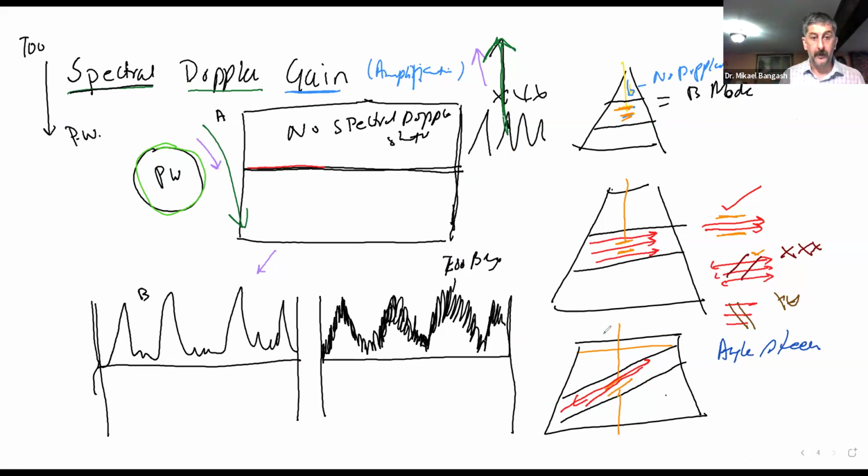But you're just going to get something which may appear as regular noise on a B mode image, which was a lot of white snowflake look-alike all over the place. Did you guys get that?